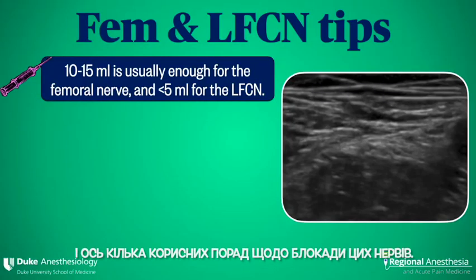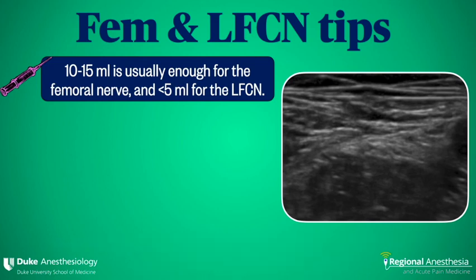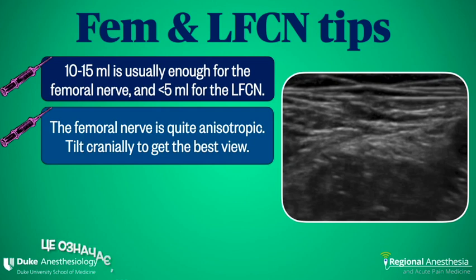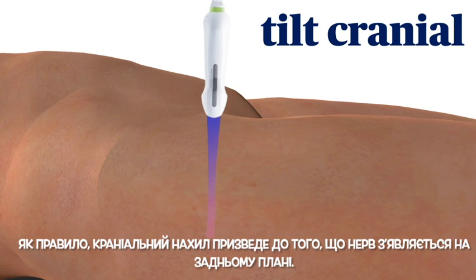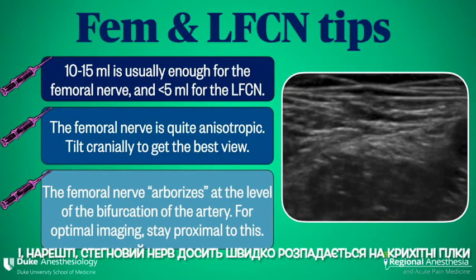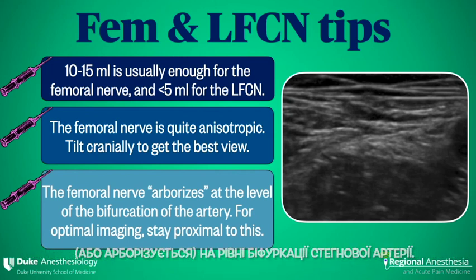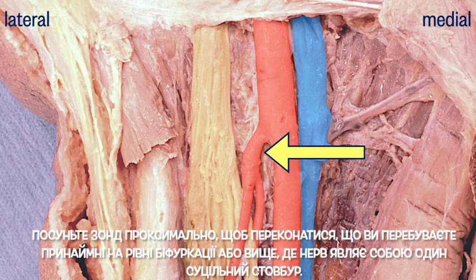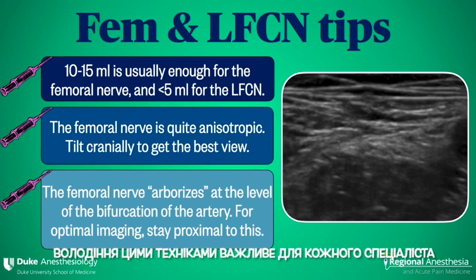Here are some tips for blocking these nerves. First, you don't need to kill these nerves with volume — 10 to 15 mls is more than enough for the femoral, and just a few mls easily blocks the LFCN. Secondly, the femoral nerve is quite anisotropic, meaning that different angles of beam incidence will cause it to light up or disappear on the screen — typically a cranial tilt will result in the nerve popping out of the background. And finally, the femoral nerve breaks up into tiny branches, or arborizes, quite quickly at the level of the femoral artery bifurcation. If you're having trouble seeing your femoral nerve, slide the probe proximally to be sure that you're at least at the bifurcation or higher, where the nerve is one chunky structure. The femoral and LFCN blocks are easy to perform, and both are impactful techniques to have in any regional anesthesia toolkit.